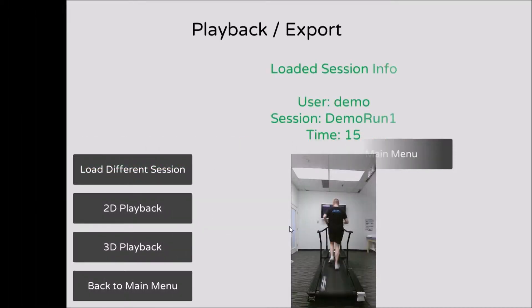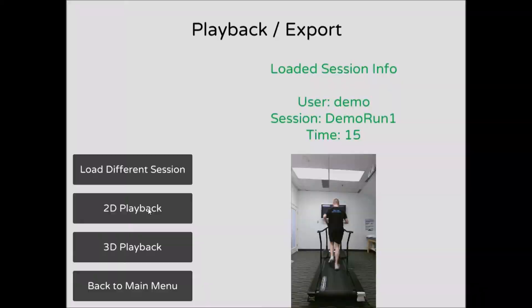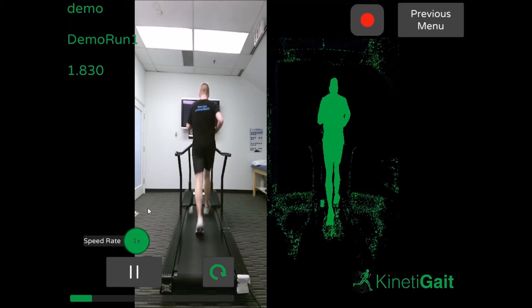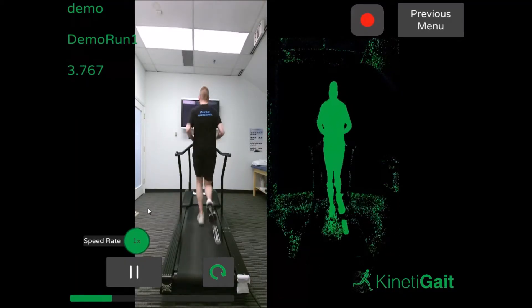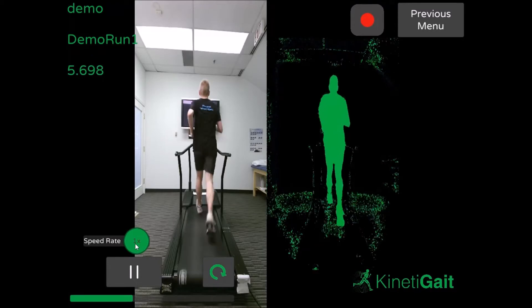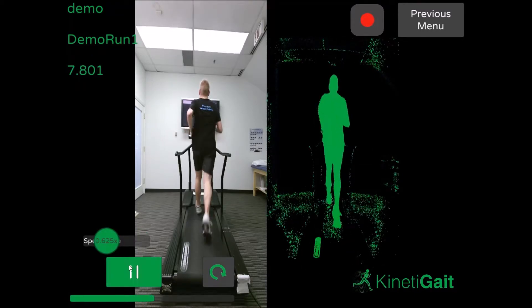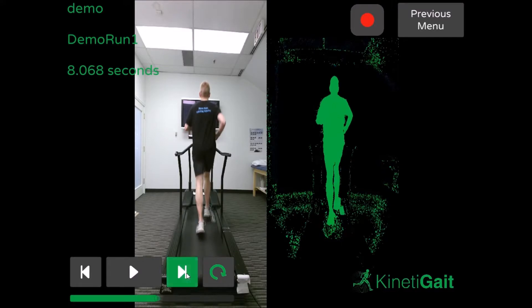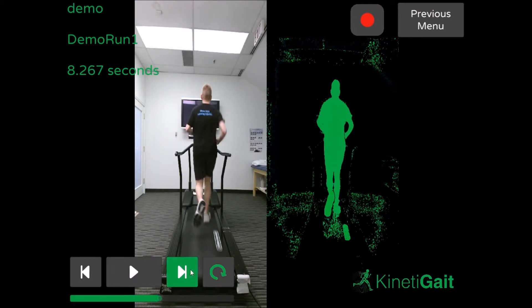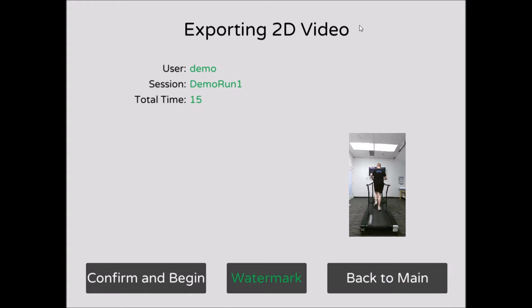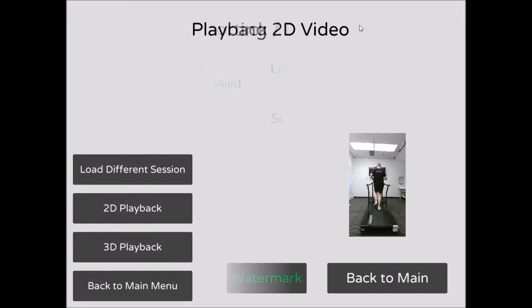In the Playback Export menu, you can choose how you'd like to view the data. 2D Playback will allow you to review the video from within the app. You can view the optical video of your session in slow motion, or pause and advance the playback frame by frame. You can also record an AVI video of your session using the record button at the top right-hand corner of the window. You also have the option of adding a custom watermark to the video.